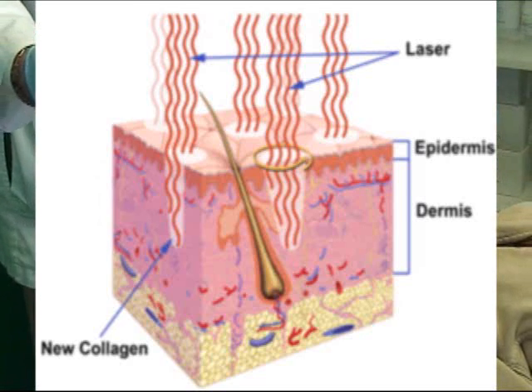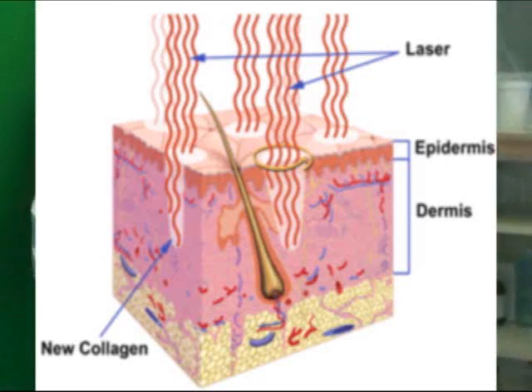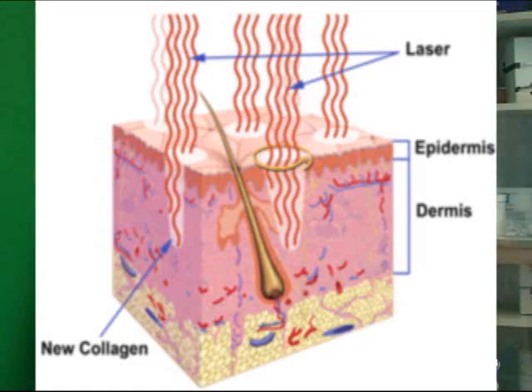You get an initial swelling and redness which occurs pretty much instantaneously, which lasts the first day, and then by the next day you're getting like a bronzed, almost suntan look. And then in maybe 10 to 15 days, if you rub your hands on the skin, you may feel a little grainy, like fine grains of sand. That is those little columns of skin that are moving out.